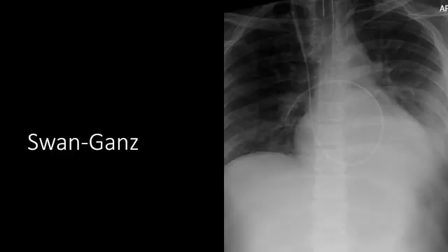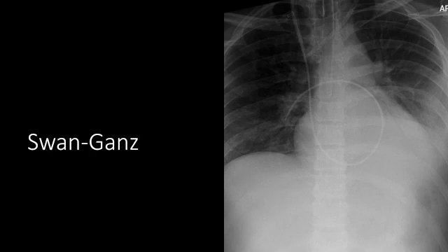This image depicts a Swan-Ganz catheter, which are rarely used nowadays. Technically, these are central venous catheters that head through the right atrium, right ventricle, out through the pulmonary outflow, and should be parked somewhere in the main pulmonary arteries. You do not want the catheter tip to be beyond the border of the hilum. These were historically used to measure right heart hemodynamic indices, pulmonary arterial, and capillary wedge pressures.